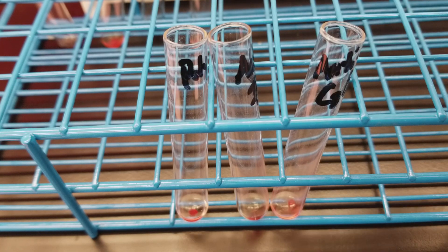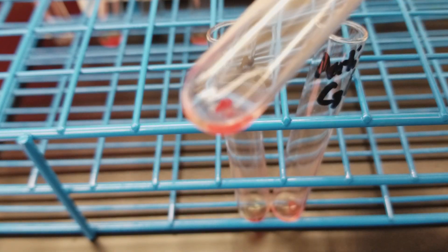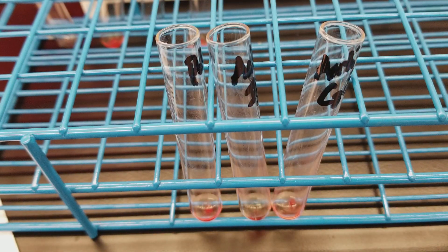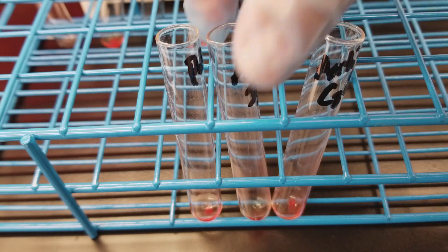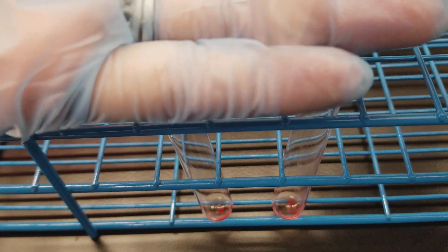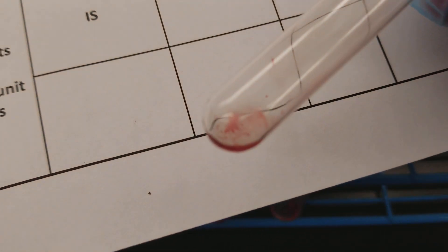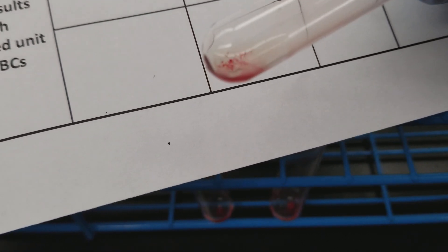We're back and I just got these out of the centrifuge. So the poly is very positive. We got a three. So we're going to write that down. Three plus poly. And then we have a positive, but not so strong of a positive of the IgG. We're going to call that a one or a two. Let's go two.